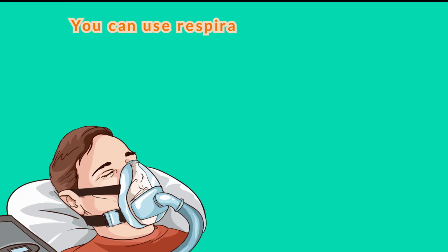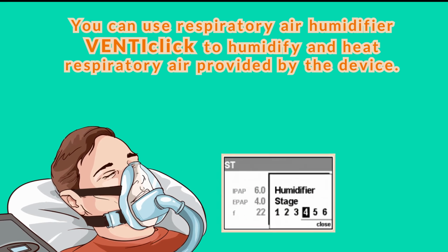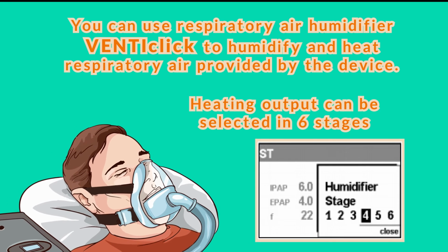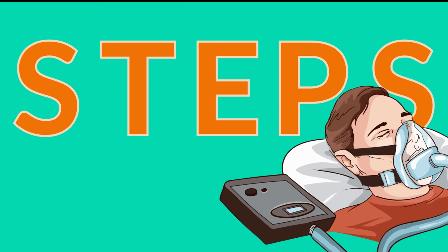You can use respiratory air humidifier VentiClick to humidify and heat respiratory air provided by the device. Heating output can be selected in 6 stages, but follow the instructions for use for VentiClick. The steps are as follows.